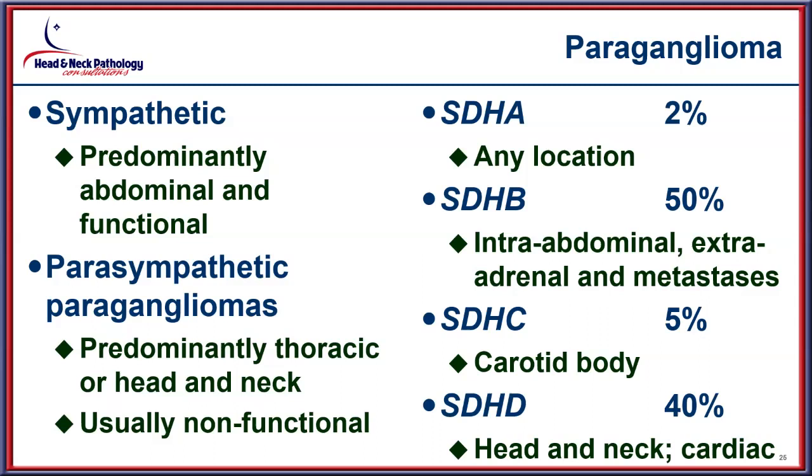So this is why it is clinically important to perform SDH testing whenever you have these, and the SDHB immunohistochemistry is certainly easily available and readily something that can be done in your lab or as a send out.